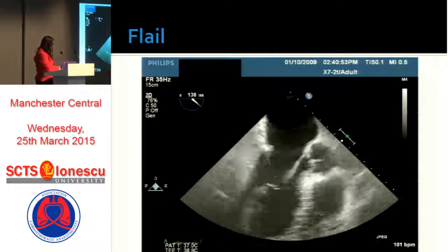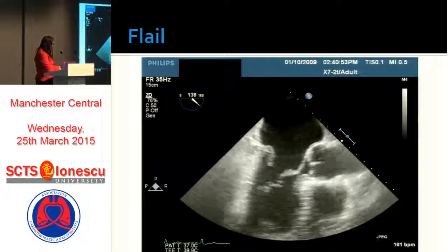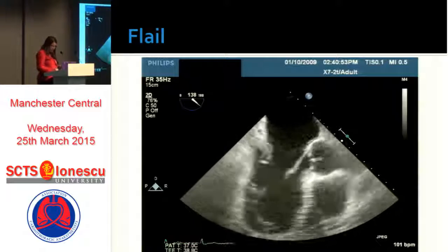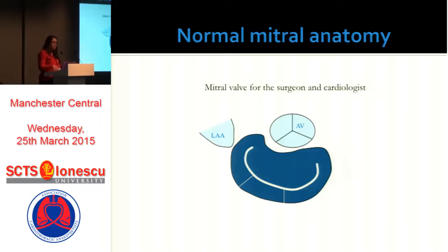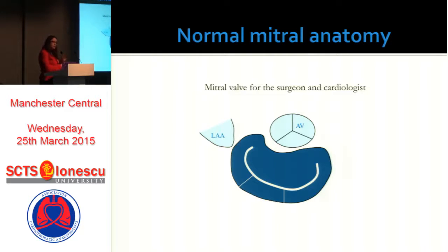Here's an example of complete overriding of a leaflet with ruptured cords attached at the ends. The more important part of functional assessment is actually where the valve is leaking from. This is quite difficult from TOE, which gives 2D cut planes that you have to conceptualize in 3D — unless you have 3D echo available. When thinking about whether the valve is leaking from P1 or A2, we need to know our anatomy.